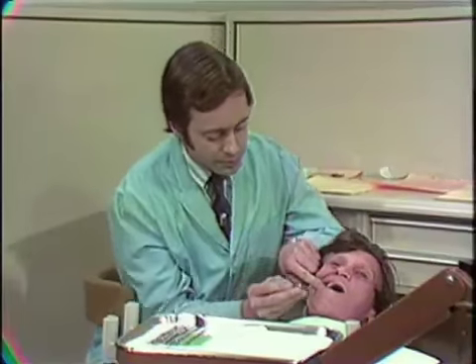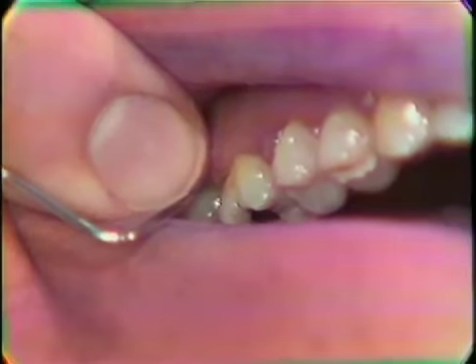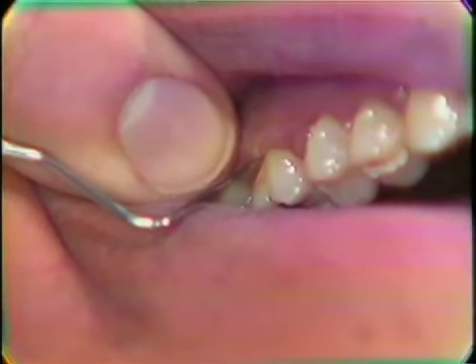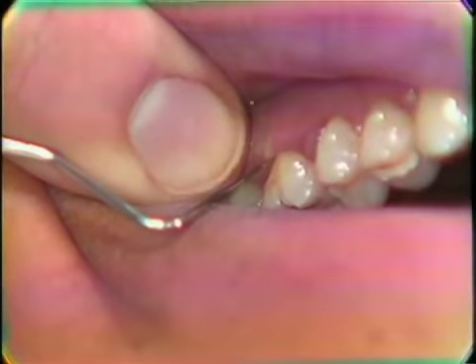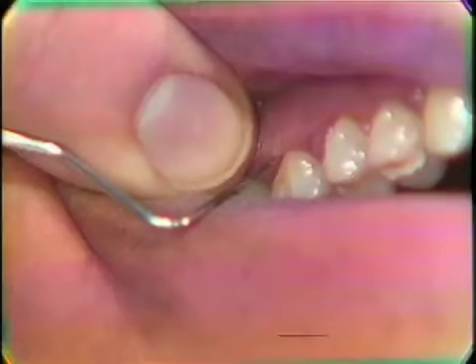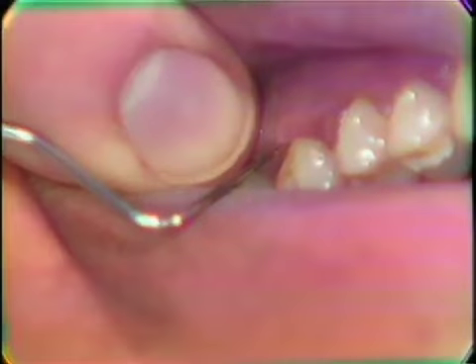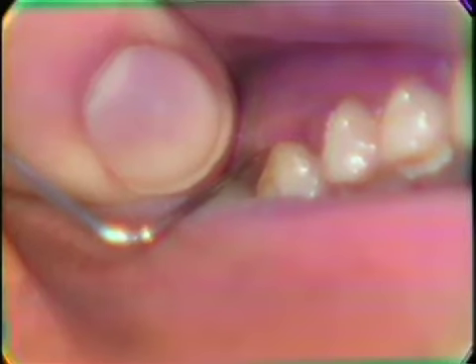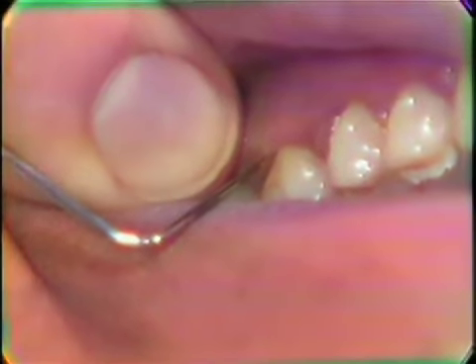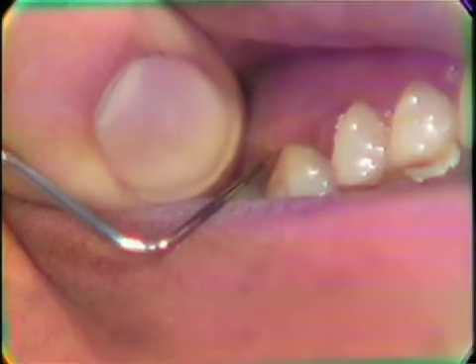Generally, the probe should be angled out at an angle of approximately 45 degrees from the tooth, entering the sulcus area and eventually encountering the area of the cementum enamel junction. In this case, we'd have a measurement of about 1 millimeter between the free gingival margin and the cementum enamel junction. In some cases, where the gingiva is tightly adapted around the tooth, you may not be able to angulate the probe out quite as far as 45 degrees, and a compromise must be made in this angulation.